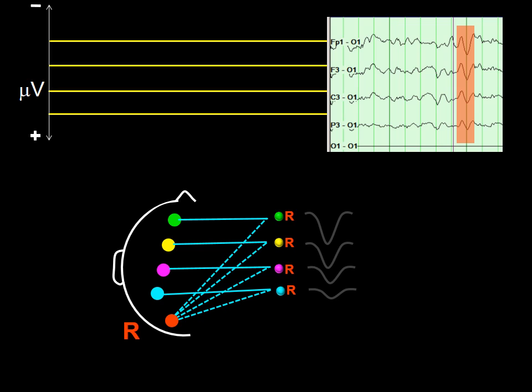The first assumption is that we are capturing all the electrical fields present at the scalp at the point in time the electrical element is being captured. And the second assumption is that the whole head is involved by a single field.